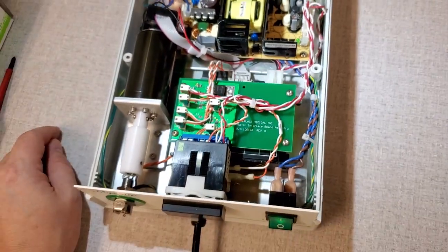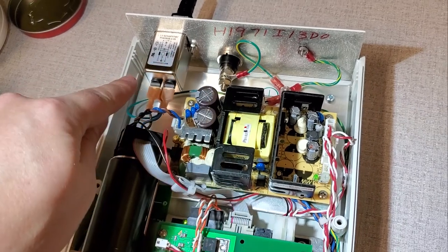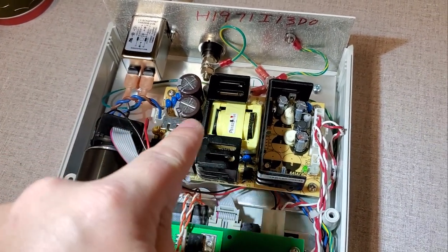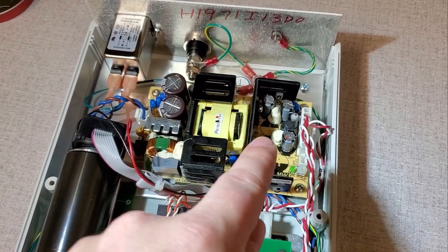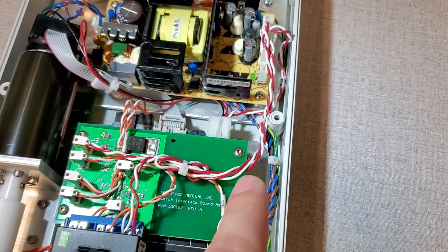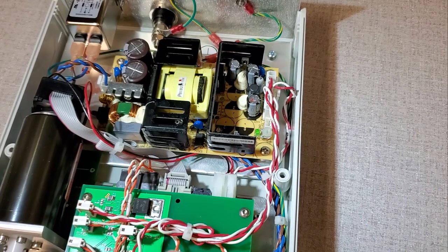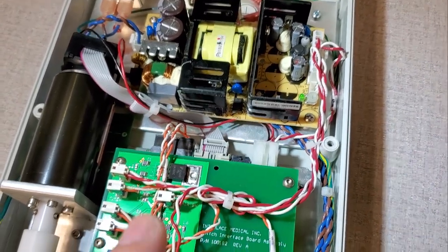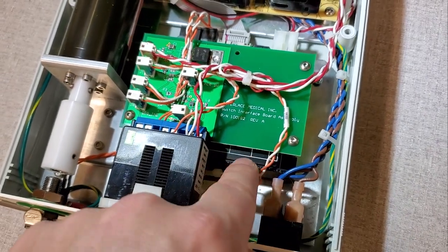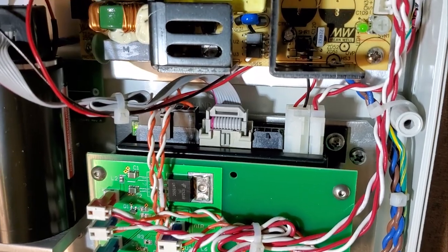So what's going on inside this console? You have your AC that comes in back here at your RF filter, or EMI filter. Comes down in here, and this guy is your low voltage DC power supply. I'm not really sure what voltage comes out of it, but it's probably about 9 to 12 volts, I would assume, based on the size of it. And down here, this guy right down here is a servo driver. You can see it kind of buried underneath there.